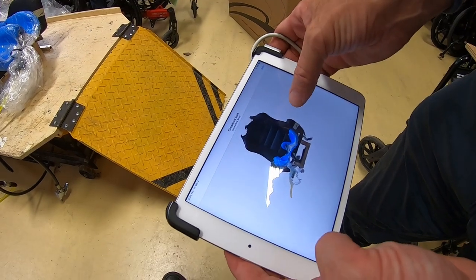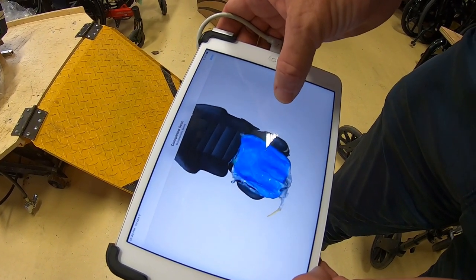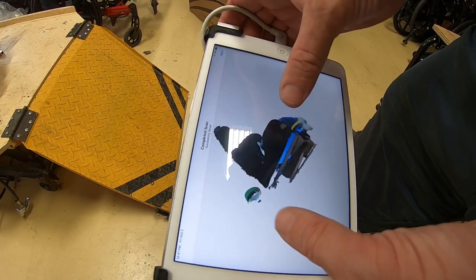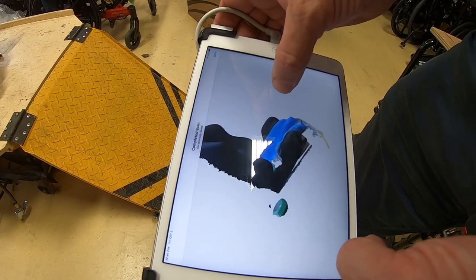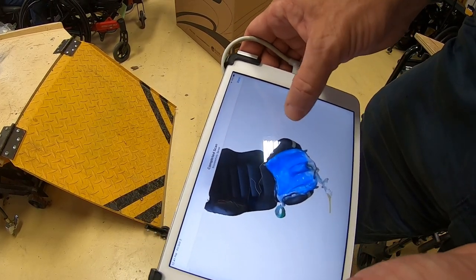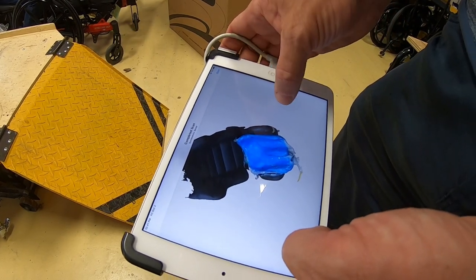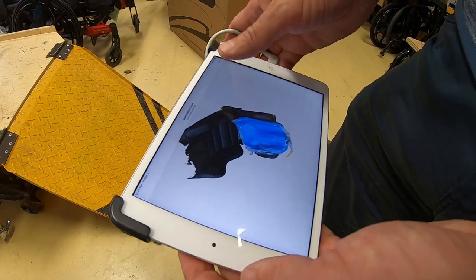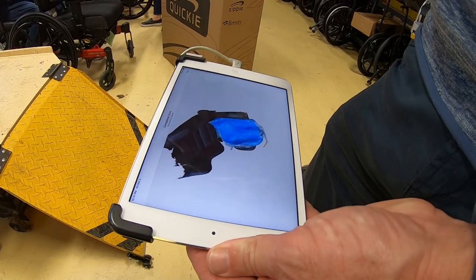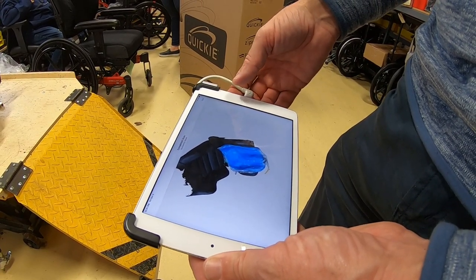We've just done the 3D scan, so you're actually able to see all of that mold. They'll take that and put it into their CNC software at the factory and manufacture a custom cushion. They'll offload the bony areas that you're susceptible to pressure sores, so it will not only protect your skin but give you better stability. You won't rock around because it'll really come up and capture your pelvis, similar to the seating in your wheelchair.